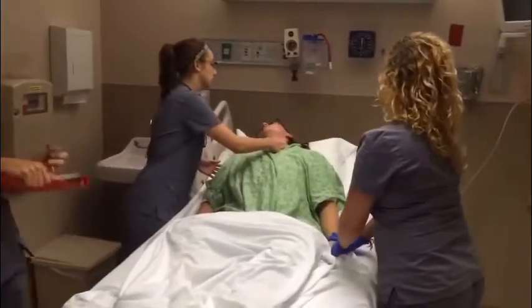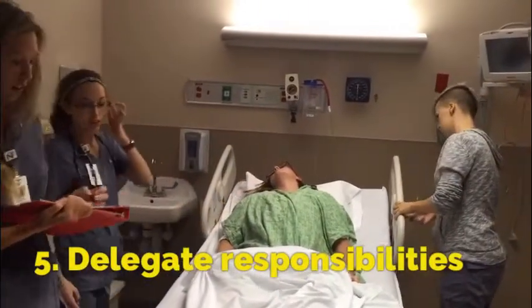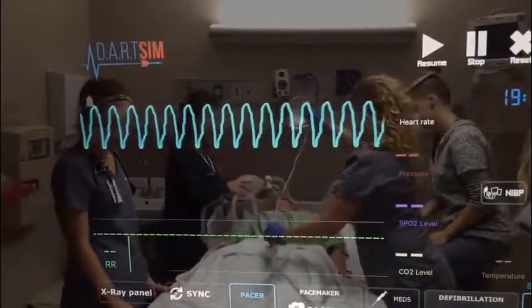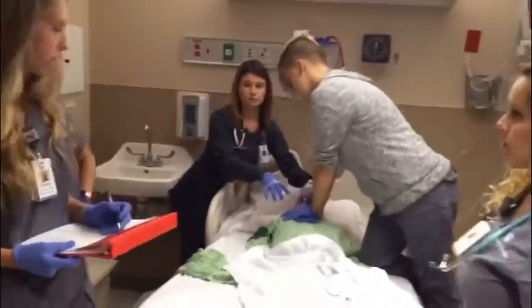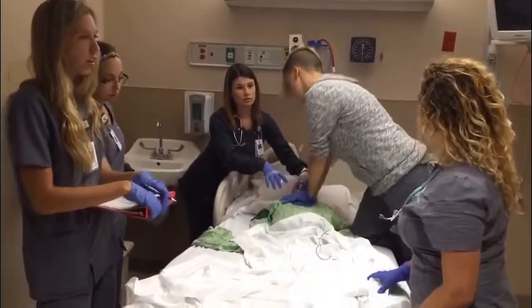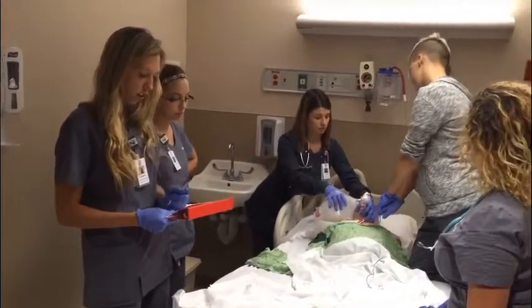Okay. She has no pulse. Estelle, can you get over here and start compressions? Okay. I'll document it. Good idea. I'm drawing up 1 milligram of epi. Compression started. I'll go ahead and document it. I'm the RT. Does she have any history of any respiratory issues? She does have a history of asthma. Her pulse was at 134 and her respirations were at 22. And she went into pulseless V-tach.